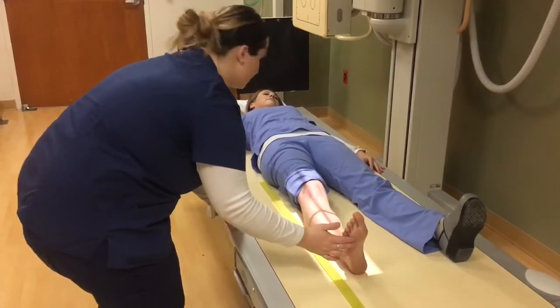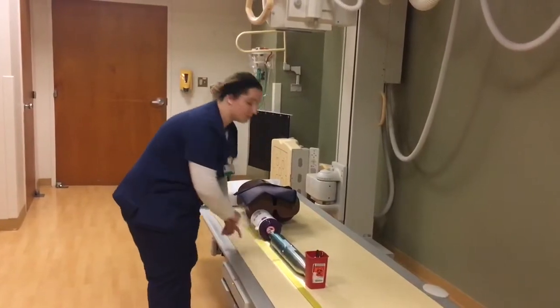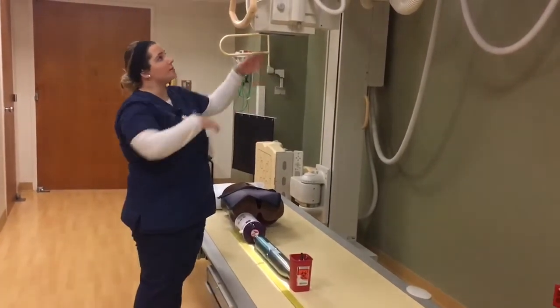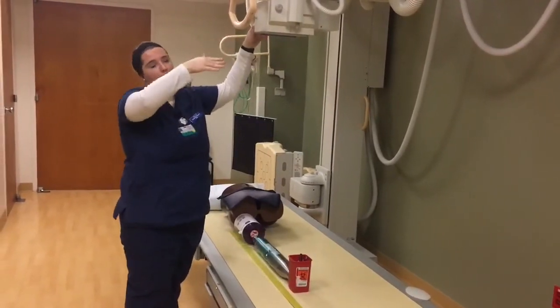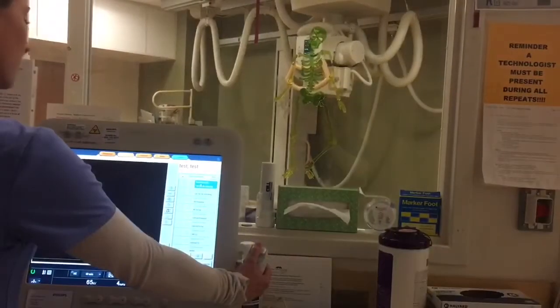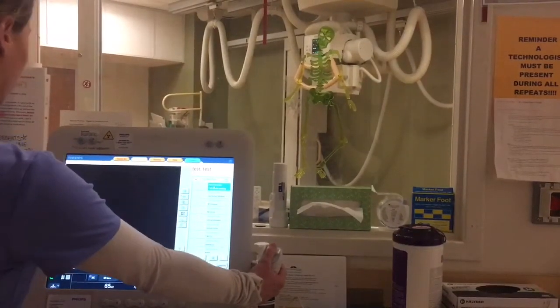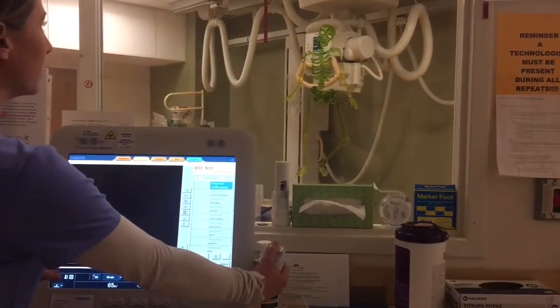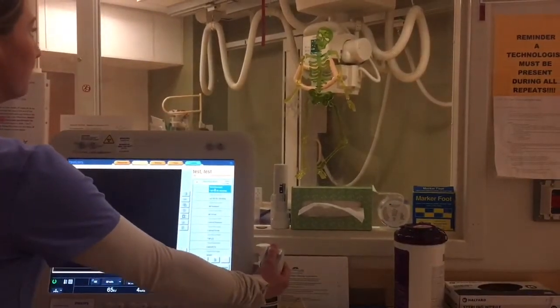Shannon, could you flex your toes towards the sky? Great. We've made sure that our part is straight, but we also have to make sure that our ruler is straight as well. Also, we can't angle our collimator box or else the machine will not stitch the image. All right, I'm going to take the exposure now. I will have to see that not only one image is taken, but 2 have been taken. And you'll hold it down until the tube is in neutral position.